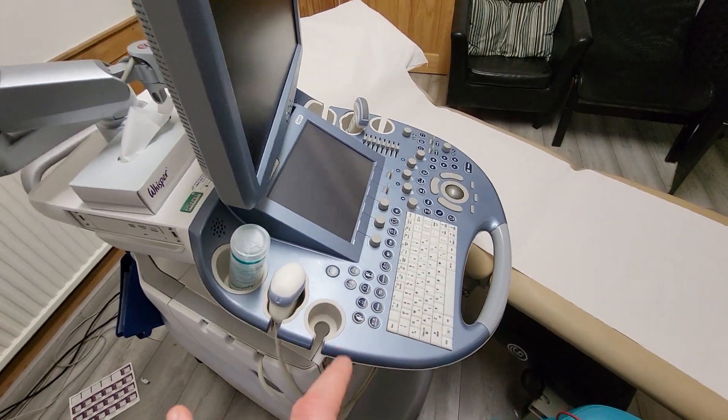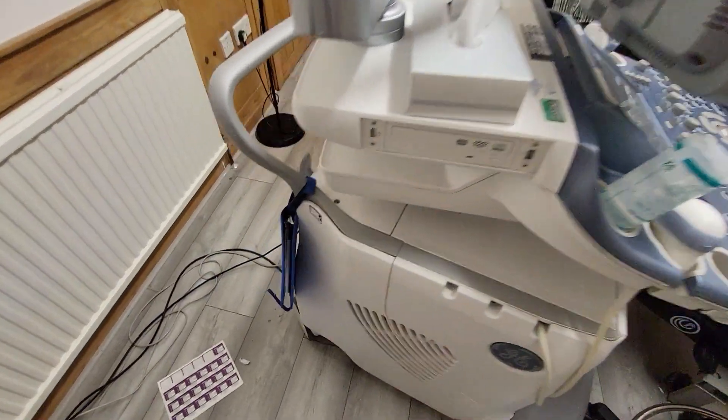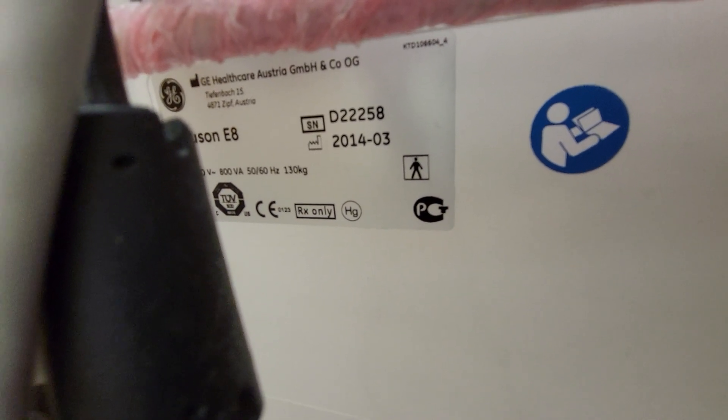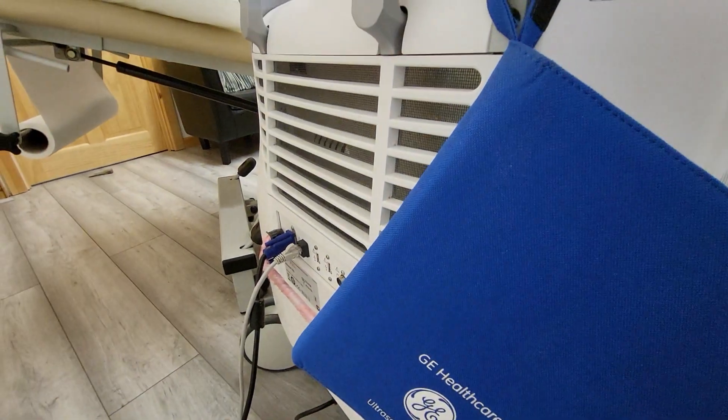You'll come across machines like this particular medical device. And if we come round and show you, you will see — sometimes on the equipment — there's a little logo of a person in a square. That determines that this piece of equipment is a medical device.